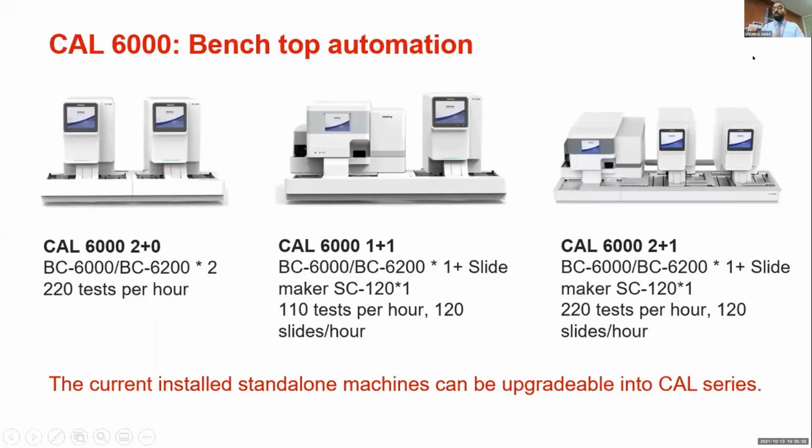And based on Lab Expert, we can set up some rules. For example, for some specific positive patients, we can automatically do the smear here in this machine, SC120.